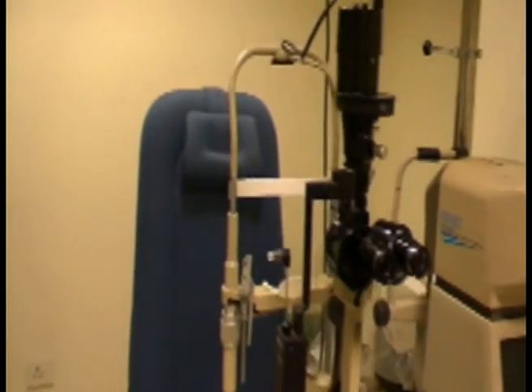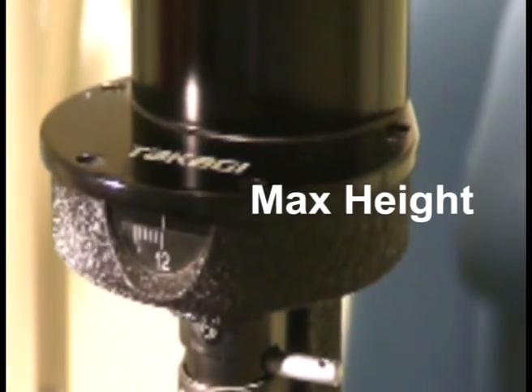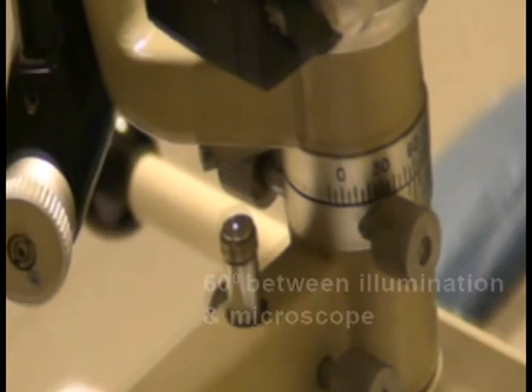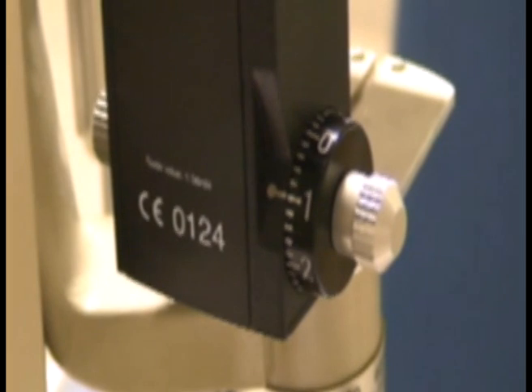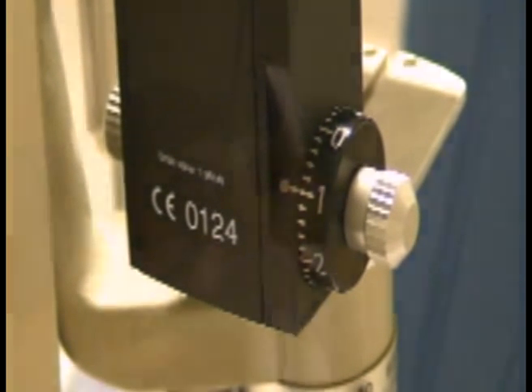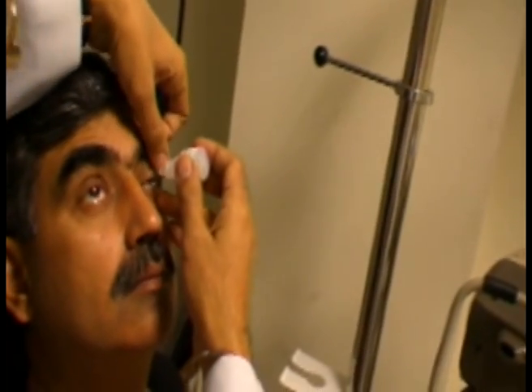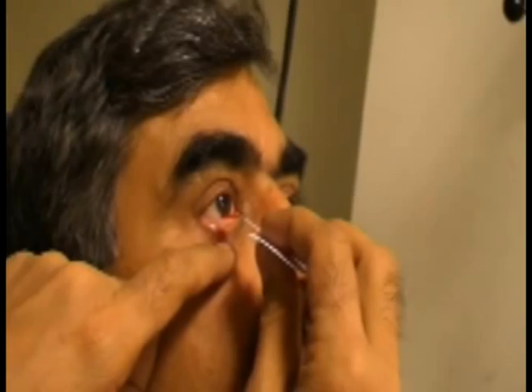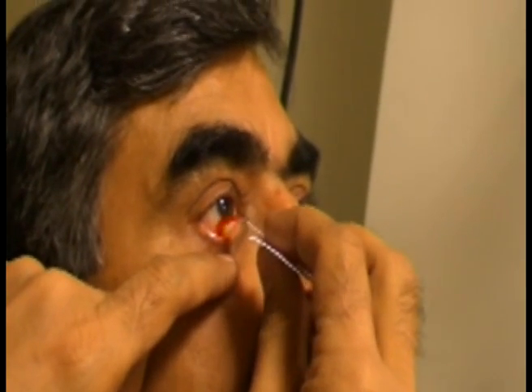Equipment preparation includes setting the magnification at 10x, switching on power to maximum light and beam to maximum height, bringing the blue filter in place, and creating an angle of 60 degrees between illumination and microscope. After this, turn the measuring drum to setting 1, which is equivalent to 10 mmHg of intraocular pressure. After informing the patient regarding the procedure, anesthetize both eyes with proparacaine. Place a moistened fluorescein strip in the lower conjunctival sac and place the head of the patient on the chin rest.